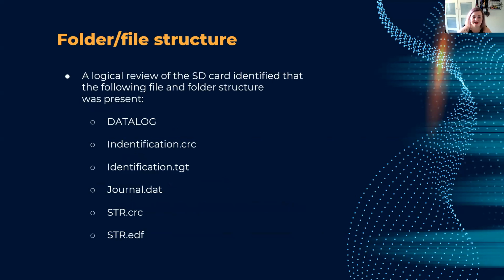And now if we look at the folder structure, and like I said, this was a non-destructive way of looking at the data recorded on the SD card of the machine. I haven't opened the machine yet, because at that time it was under warranty and it was actively used by my dad. So I didn't really want to go mess with things to a large extent.